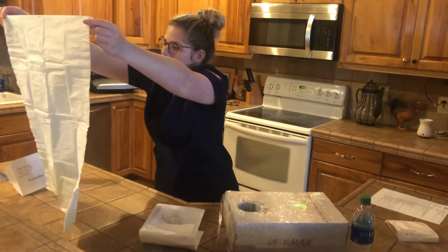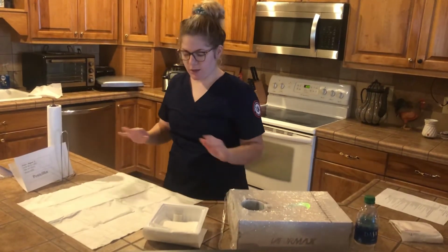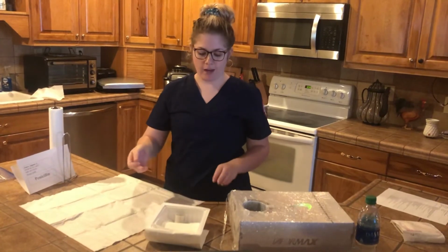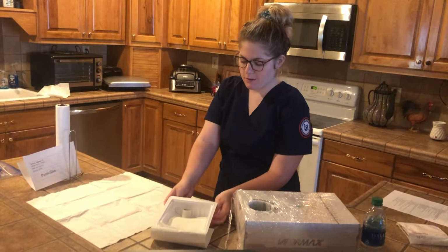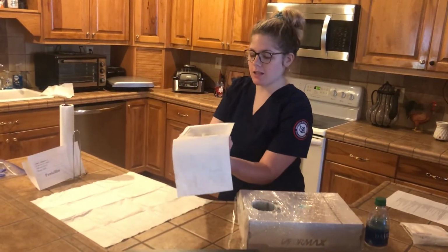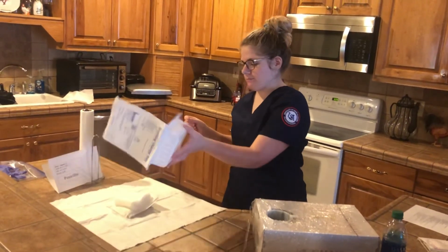I will lay it blue side down, and anything draping below the table will be unsterile. I now will not reach over my sterile field, pick up the contents of my container, not touching the top of it, and dump them out.